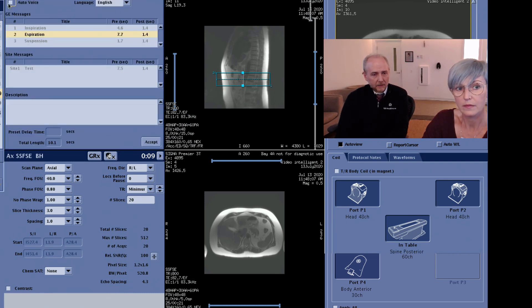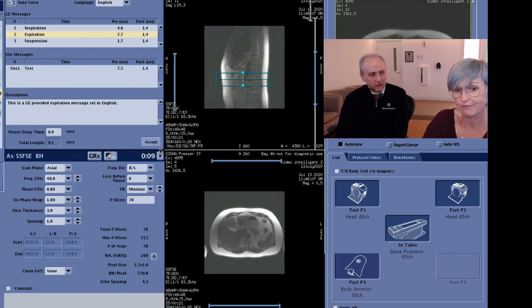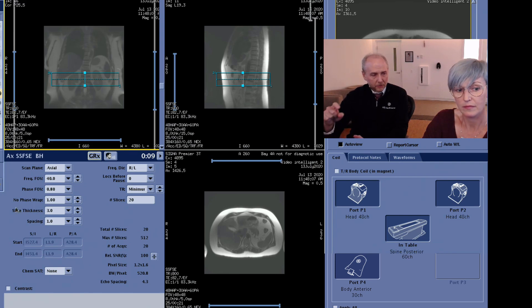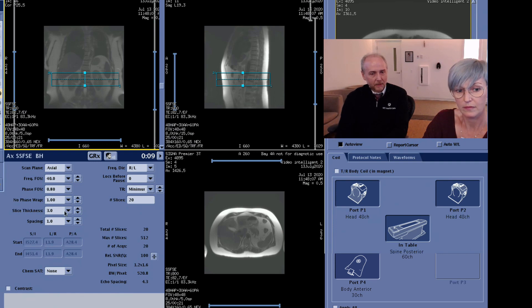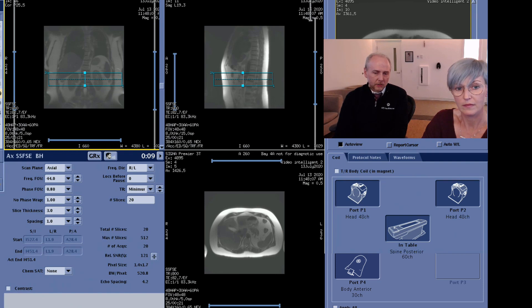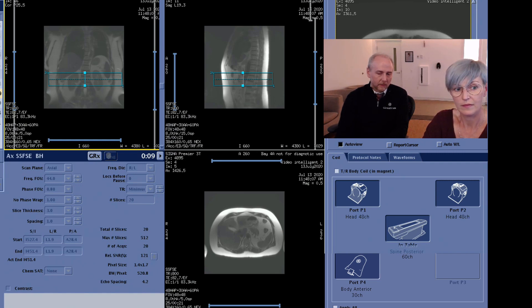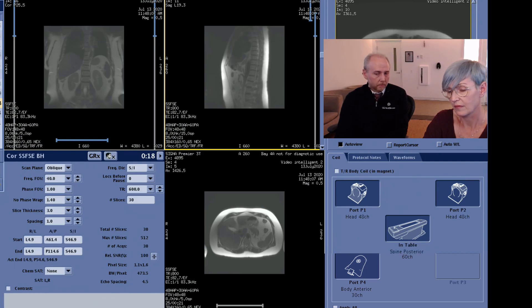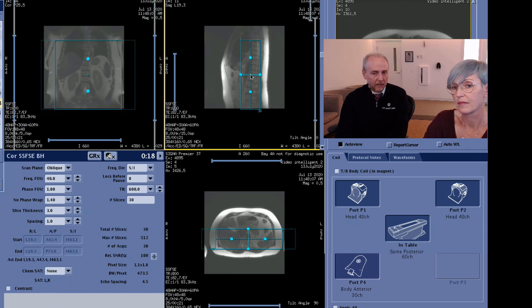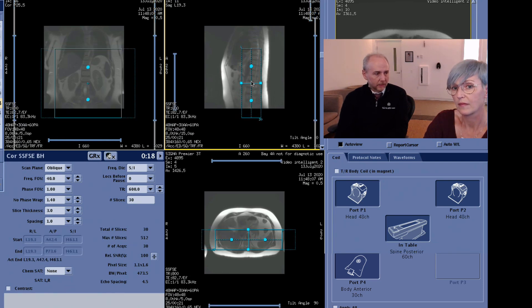In the past, there was a list of configurations that technologists would feel they needed to go through, not really being sure which configuration was the correct one to use. AirTouch really automates this whole process. You have these icons over to the right — a page that lists out all of the coils plugged into the table. You just turn on the icon you want to use, and then as you graphically prescribe, the coils are being selected for you.